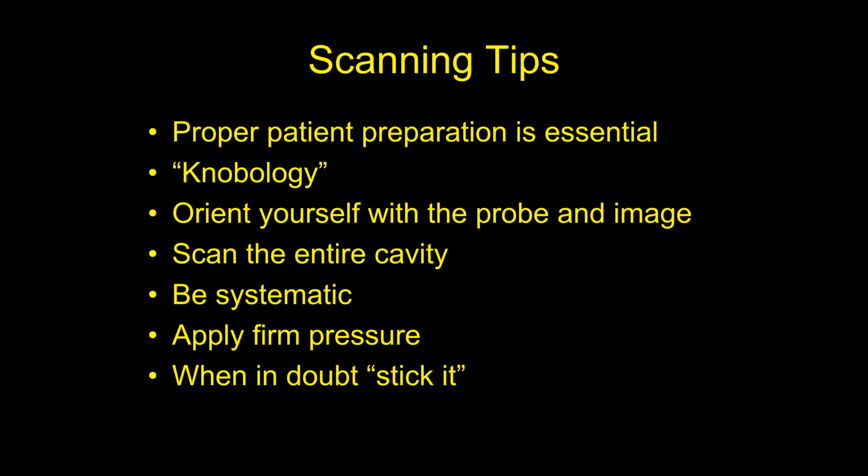There's only one thing in the abdomen, I think, that people would tell you in general you do not want to put a needle in, and that's an adrenal gland. So I would stay away from sticking adrenal glands. Adrenal glands make lots of different hormones, and that can have bad effects. They're also next to big blood vessels and things like that, and they tend to be very small. So you've got to be real careful if you're going to stick an adrenal gland. I pretty much stay away from adrenal glands when you're trying to stick things.